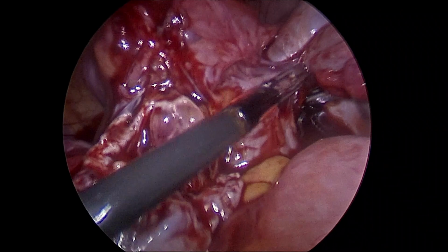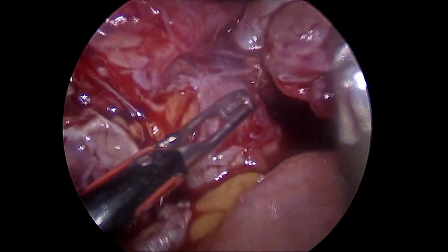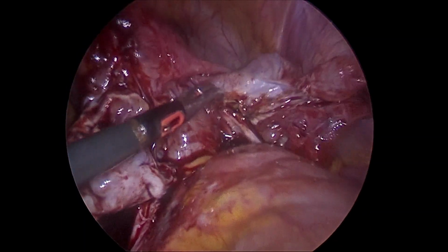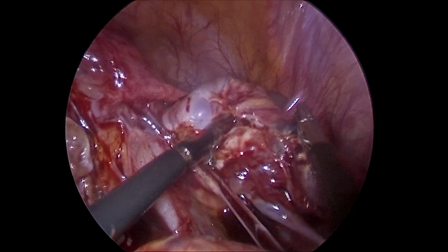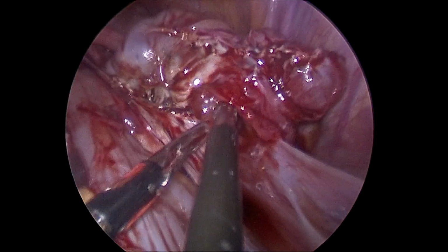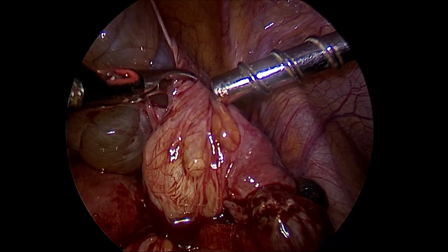This tube and ovary were stuck to each other and to the lateral pelvic wall. Along with the tube, also the ovary which got stuck badly, there were peritoneal adhesions as noted in this particular frame. So we did adhesiolysis and tried to get the tube in the normal position.